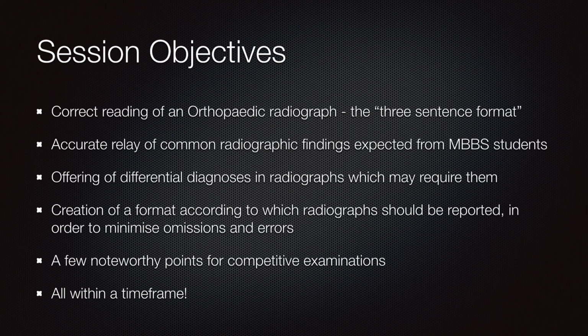At the end of this session, you should be able to correctly read an orthopedic radiograph using the 3-sentence format which we will develop through the course of this lecture. We should also be able to accurately relay some common radiographic findings which are expected at a graduate level. Followed by that, in some cases where the diagnosis of an X-ray is not obvious, it may be necessary to provide differential diagnoses, which we will provide with this format.